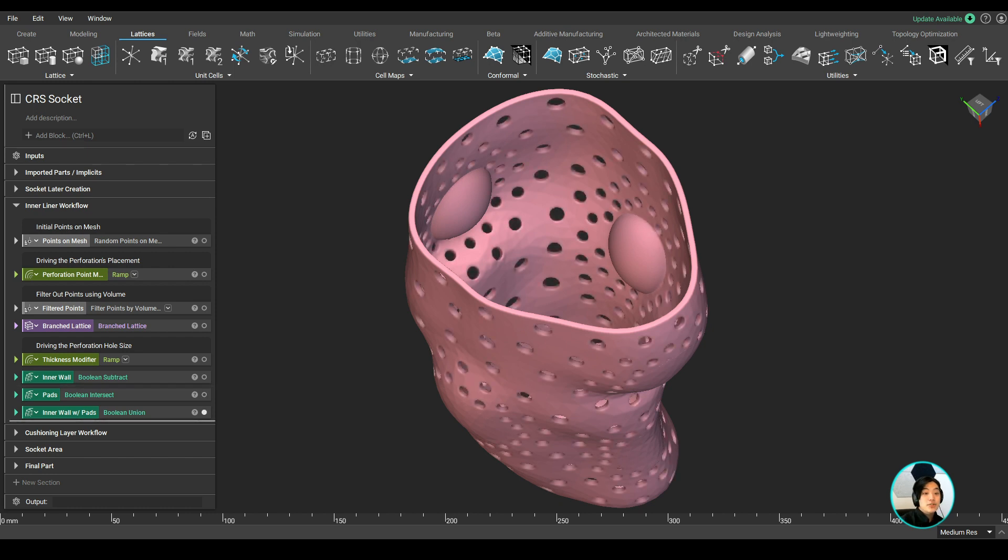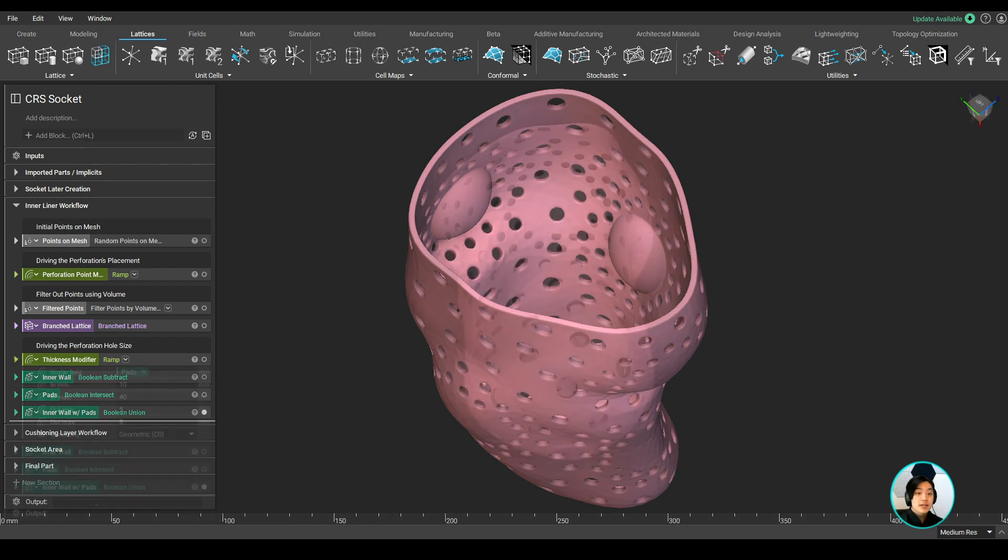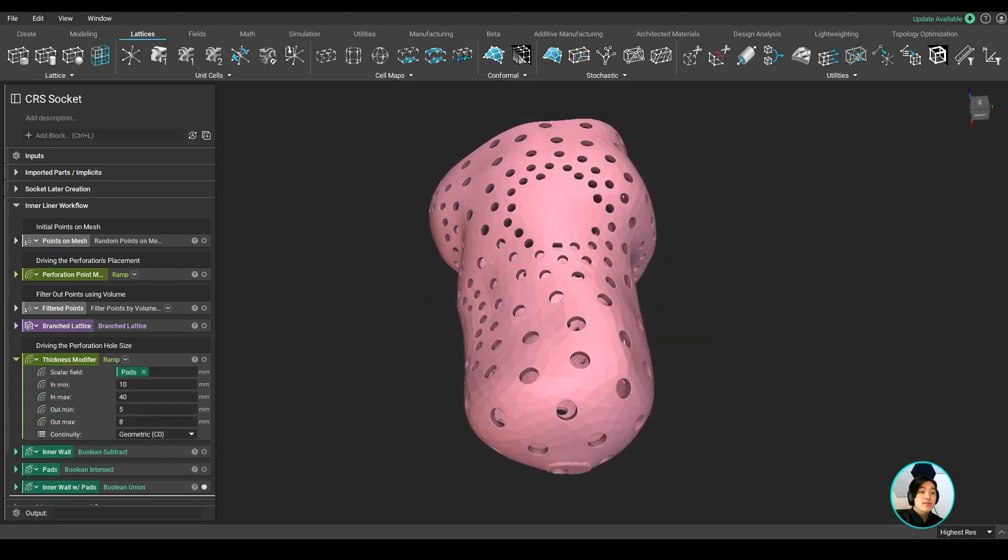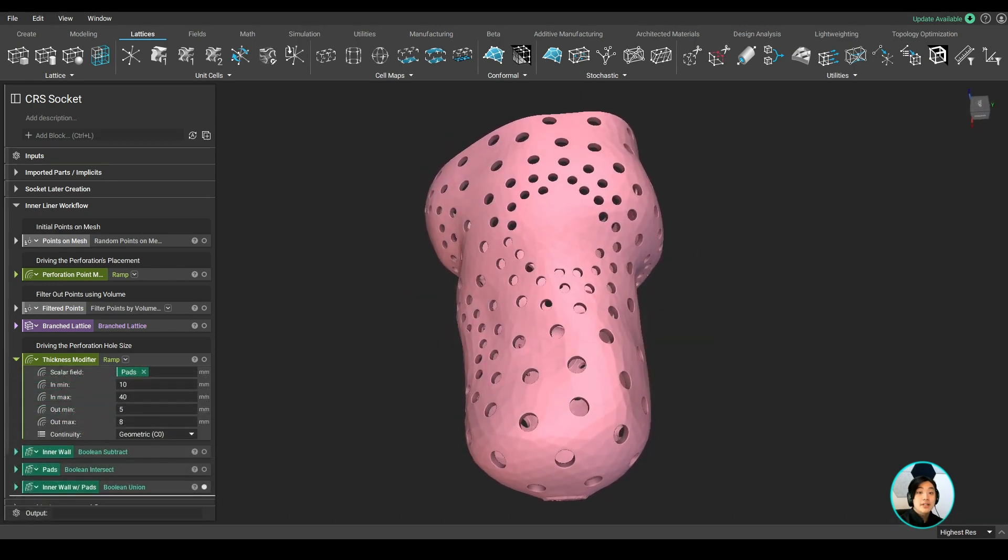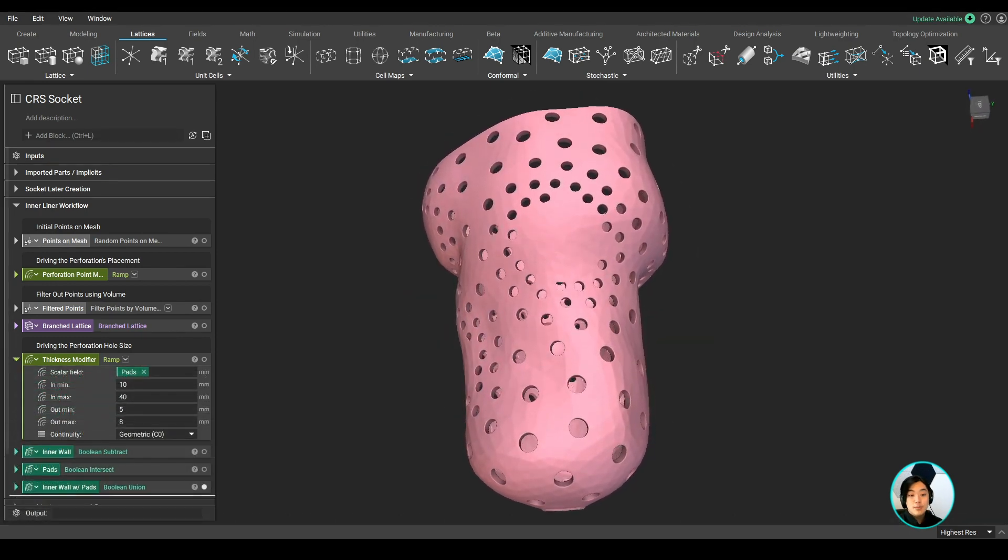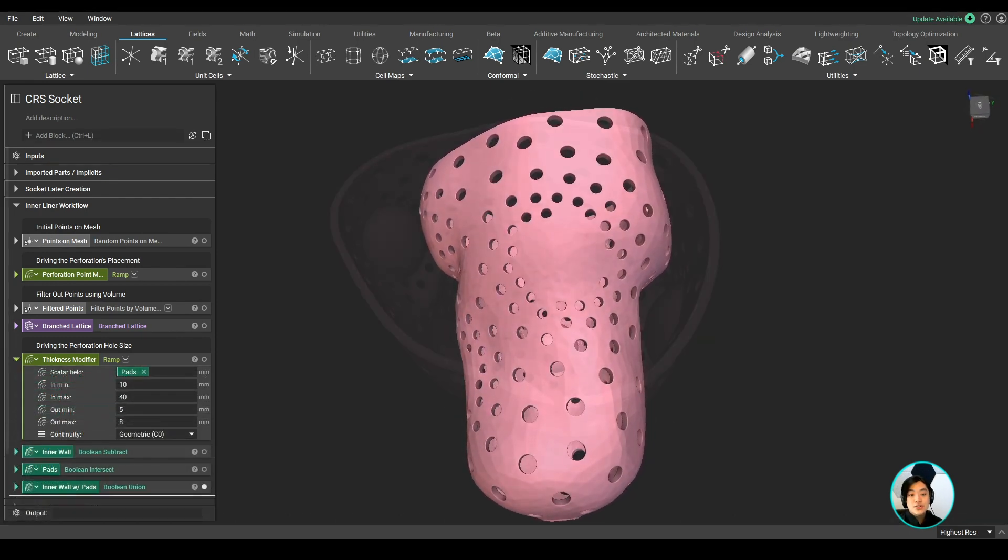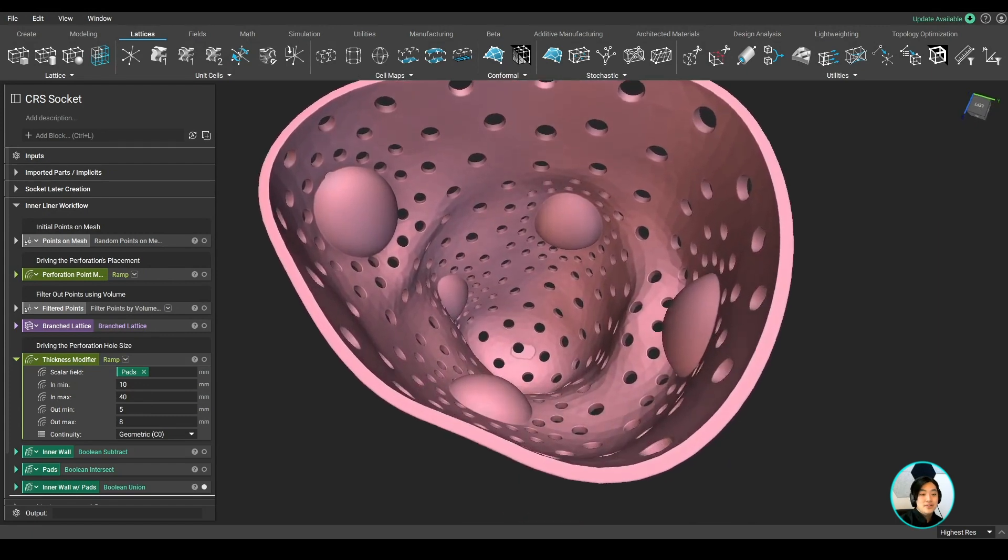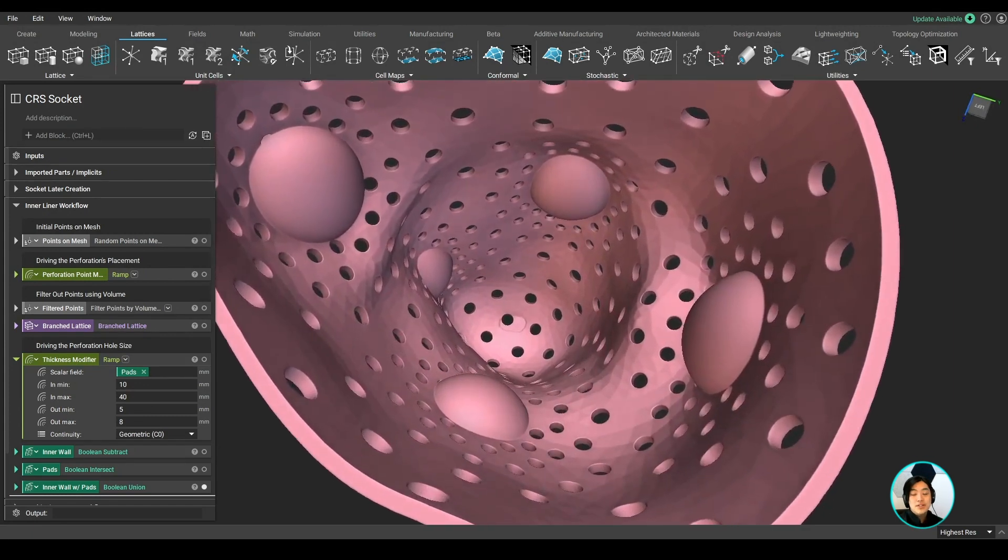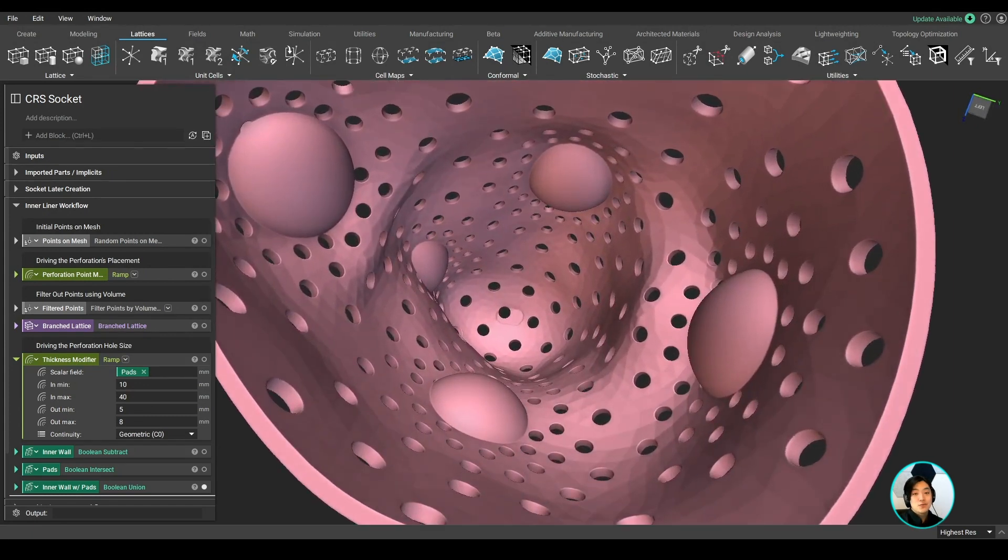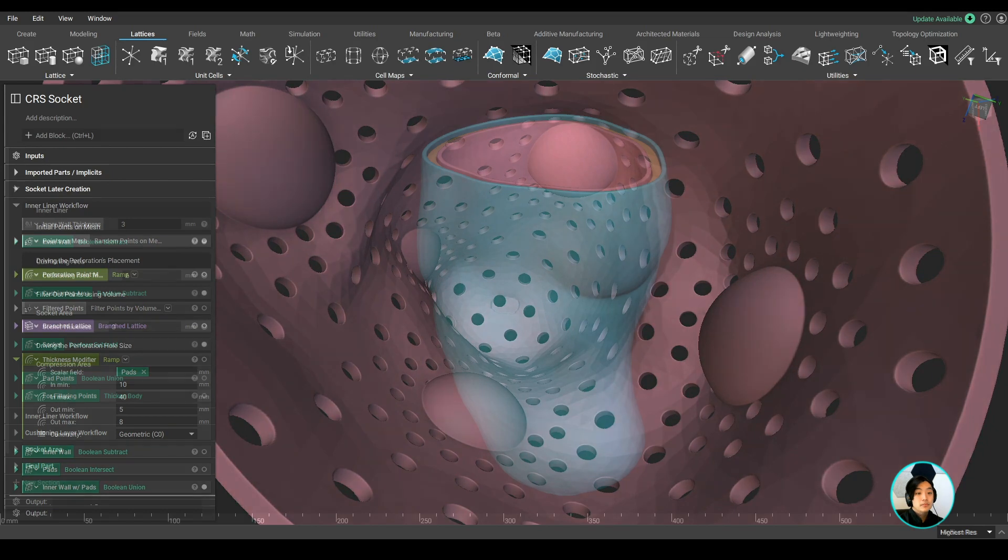These perforations can be driven by point maps or simulation data. If you can identify where more sweat is being trapped, we can easily add more perforations in those regions and get a new design iteration with smartly placed perforations using field-driven design.